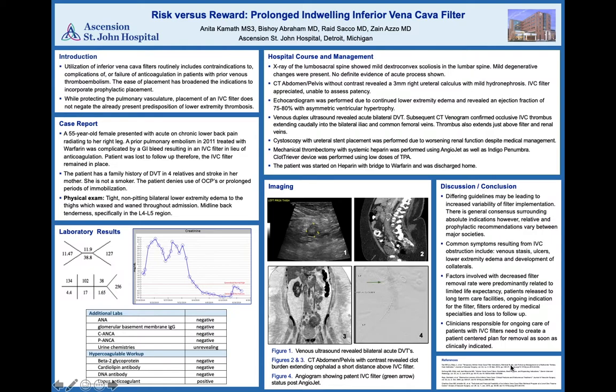However, the increase in relative and prophylactic indications for filter placement has led to a shift in practice patterns. For example, the Society for Interventional Radiology and the American College of Radiology appropriateness criteria support the placement of an IVC filter in high-risk populations, such as patients with multi-trauma or patients with spinal cord injury. But the American College of Chest Physicians opposes this indication.